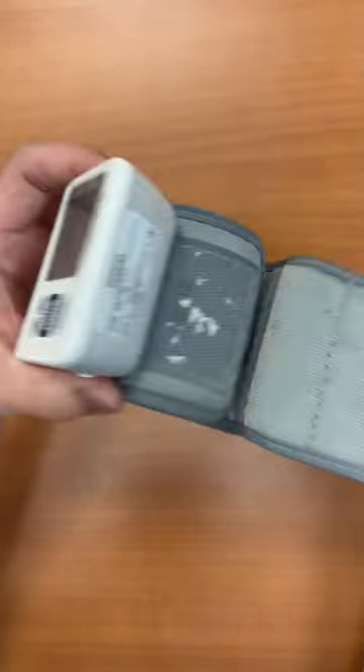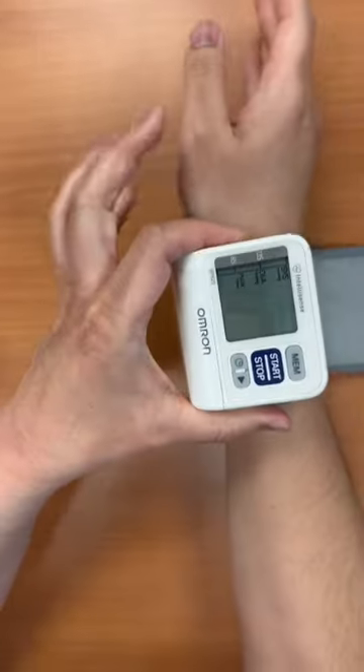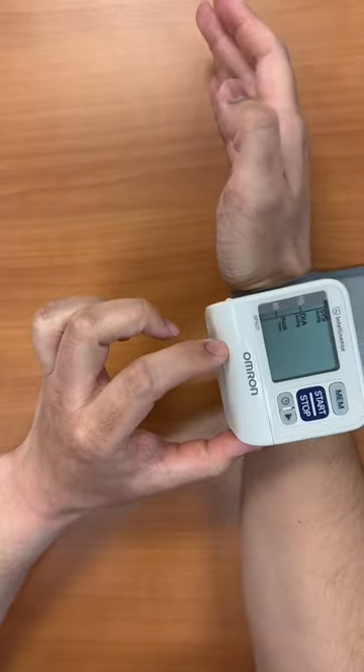If you put it on the right-hand side, the screen is going to go on the thumb side, and then you have the patient cross their arm towards their chest.